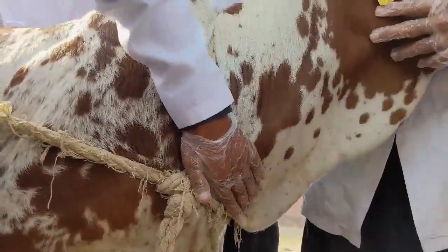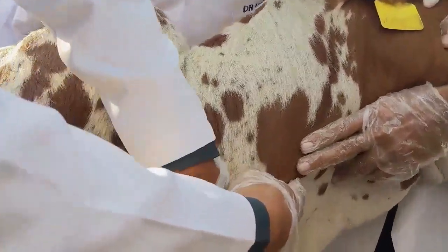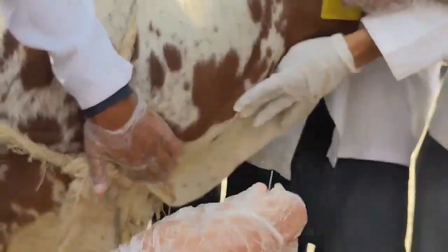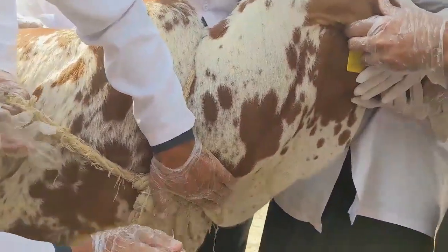How is the groove? The jugular groove — look at this. Is it clear? Let's go. Look at this — the back retainer.